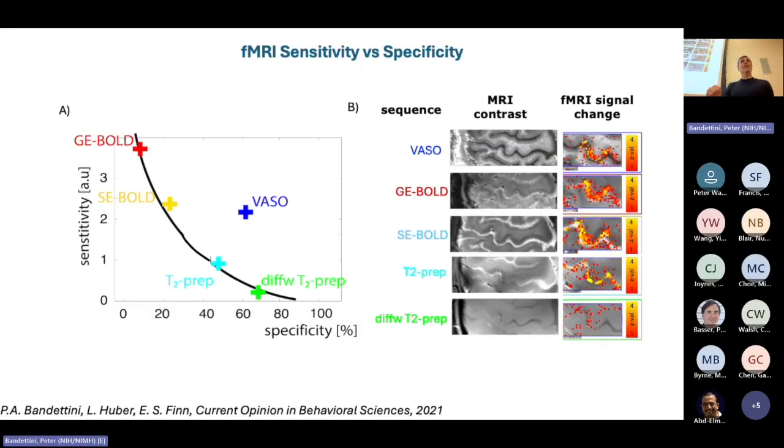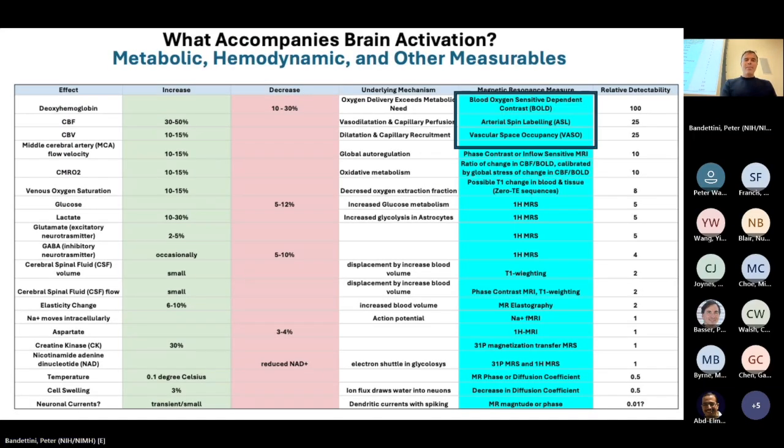And where it is on the layer, cortical layers, really does determine how you interpret the data. Upper and lower layers typically receive feedback from other areas. Middle layers receive input from sensory input, and so on. So the layer activity really makes a difference. You really can't be thrown off by large vessels skewing your signal. It makes much more of a difference at high resolution. So this is just showing you what I just talked about.